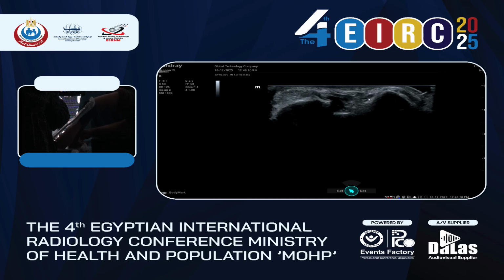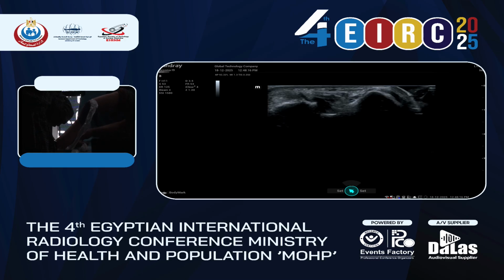At this level, the ulnar nerve might have many different appearances. You can have a nerve which is ovoid, as in this case, and you can see this characteristic honeycomb structure, or you can have a nerve which is bilobed or trilobed or rounded. And sometimes the nerve there is so hypoechoic, normally hypoechoic, that you cannot see any fascicles inside, and it is so hypoechoic that it could even mimic a vessel. But you know, because of anatomic landmarks, that this is a nerve. So at this level, the nerve is stabilized.